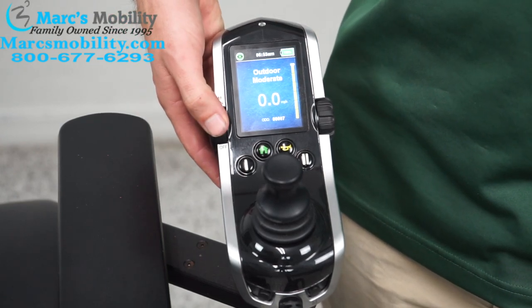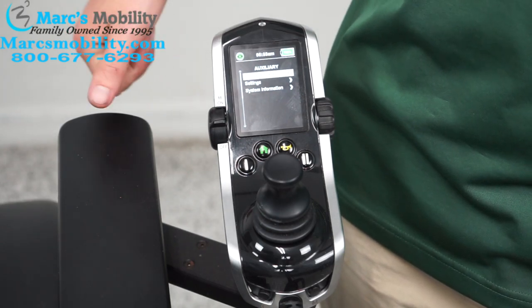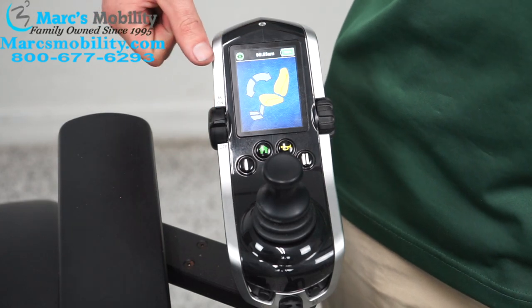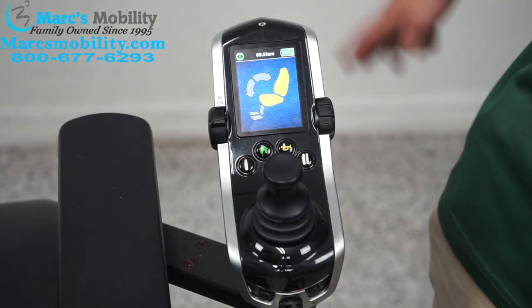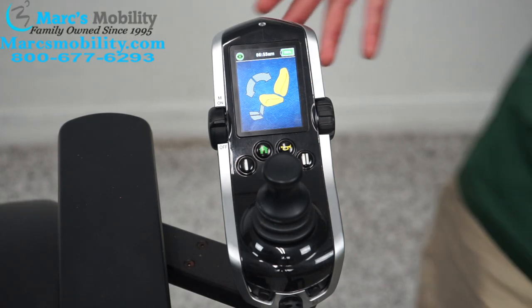Cycling further brings us to the setting menu — we'll talk about that at the end. Going up again brings us to the function menu. This is how you use the functions on your chair. Some joysticks will have a switch box behind the joystick; if not, all functions can be worked through the joystick.